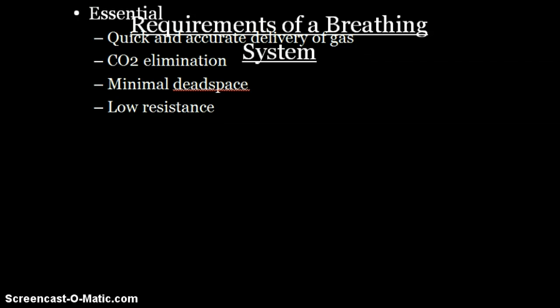Recall from physiology that physiologic dead space includes anatomic dead space, or that portion from the conducting airway to the alveoli, plus alveolar dead space, which is that portion of the alveoli that is ventilated but not perfused. Mechanical dead space contains gas that is rebreathed without a change in composition. In other words, it is stagnant gas that is not delivering oxygen or inhalational agent, or eliminating CO2 or inhalational agent. Increased mechanical dead space gives the anesthesia provider less control of the gas delivered to and eliminated from the patient. Additionally, low resistance is required from the breathing system, particularly in spontaneously ventilating patients, as increased resistance imposes strain on the patient.